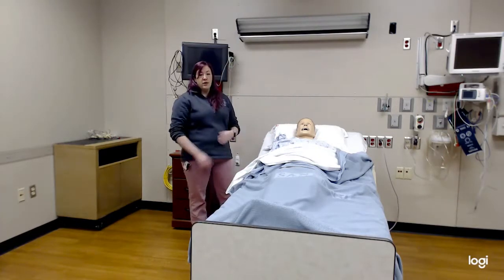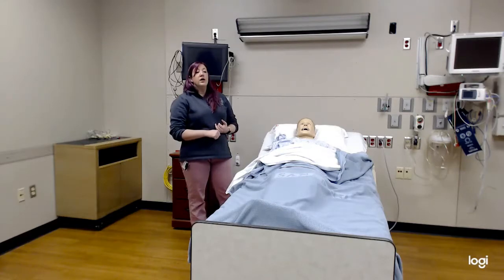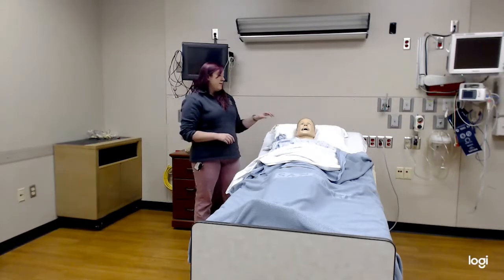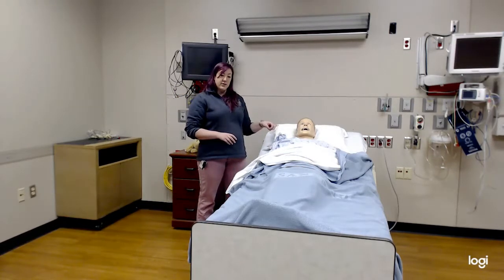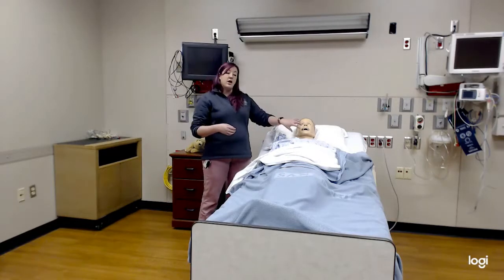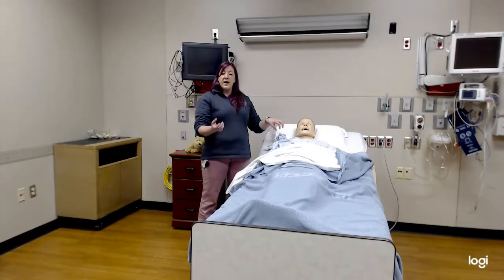High flow O2 is always the way to go. With any life threats, any problems with A, B, or C, they get high flow O2. If they can maintain their airway by themselves relatively, and they're taking adequate ventilations, you can go ahead and just put on a non-rebreather mask at 10 to 15 liters per minute. Pick one of those numbers.